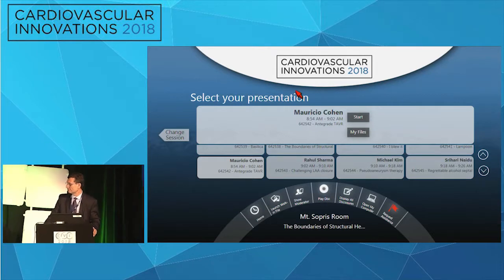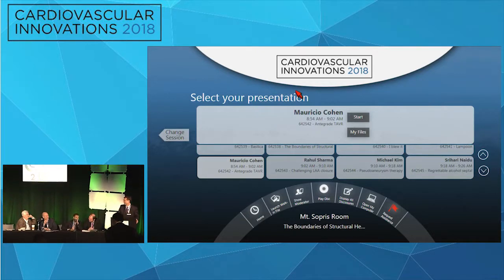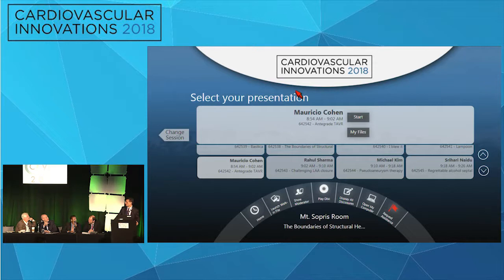Did you use ultrasound to get venous access? Yes. But you didn't use it to get transseptal access. Correct. So you must not care too much about where you puncture the septum, huh? Yes, and these were cases done in the beginning. With all the things that we know about transseptal access and where in the fossa you want to go, if you do mitral clips, if you do left atrial appendage closure and whatever you want to do, I would not recommend puncturing transseptal blind. This is a skill that early operators had, going by feel, and I don't think that you need to go by feel anymore.